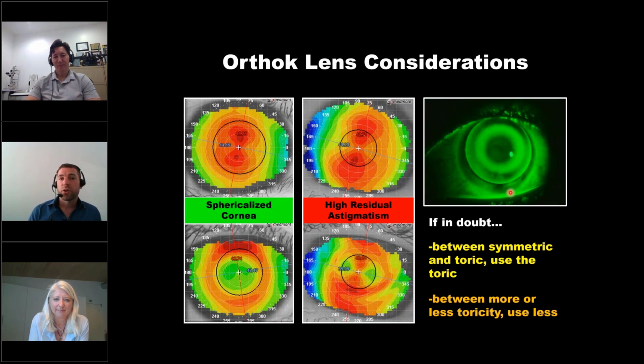I've seen cases of 4 diopters and higher as well, but then you're looking at custom Ortho-K lenses. You won't do that with your off-the-shelf Ortho-K standard design. You'll need toric peripheries. You also have corneas which are steeper compared with the flatter corneas. You won't achieve that much cylinder correction. So it's dependent on various factors, of course.